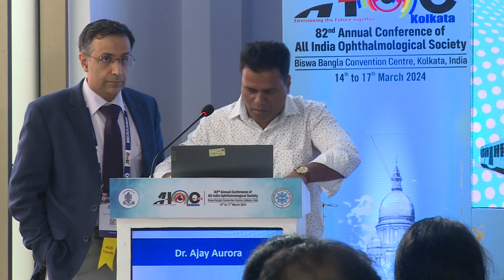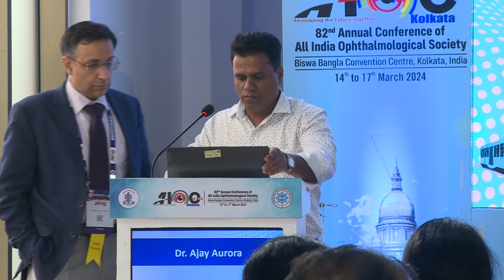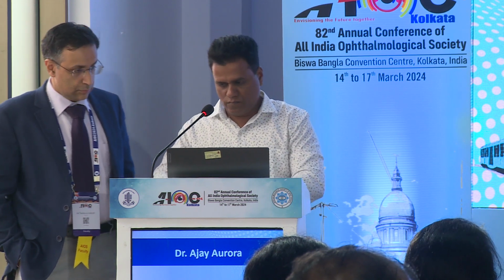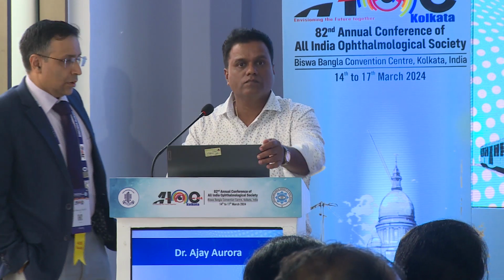Can you explain a little further on the first thing? I always felt that even with all the so-called true colors or near-true colors, the images anterior to the anterior retina are mostly greenish, blackish.